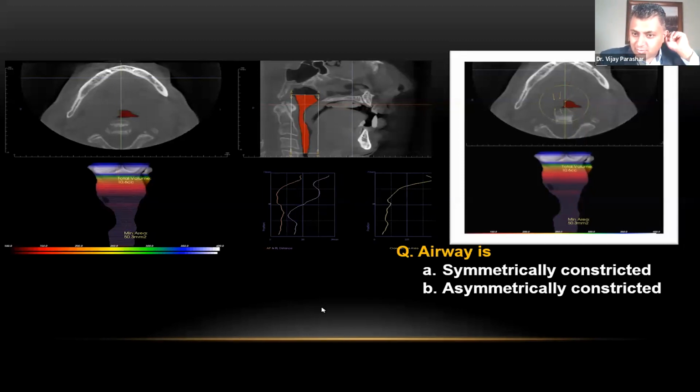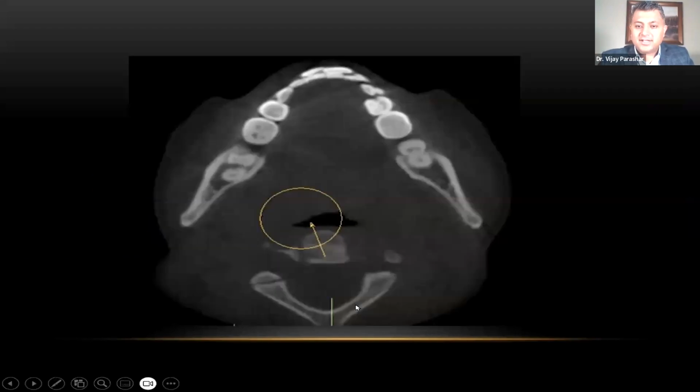Yes, Dr. Joanna, a lot of our doctors are saying that, yes, awesome. It's changing so fast. Yes, it is asymmetric and it matters.